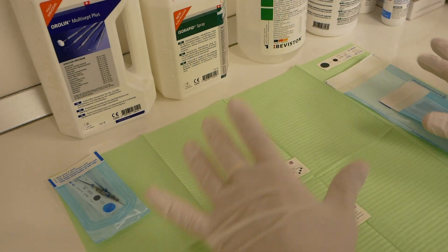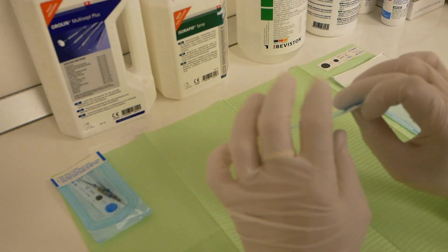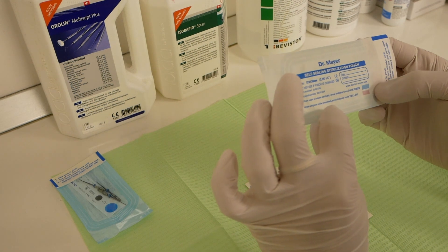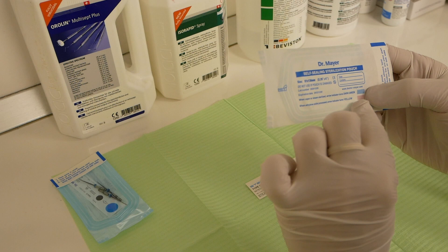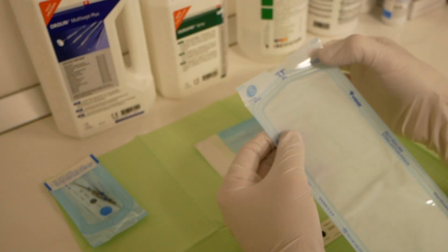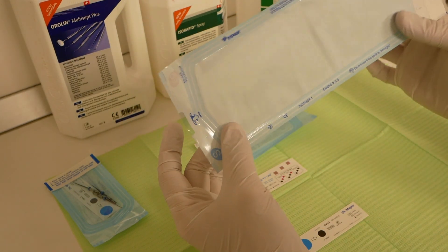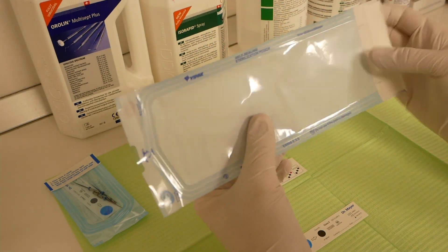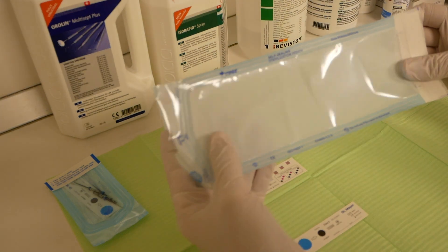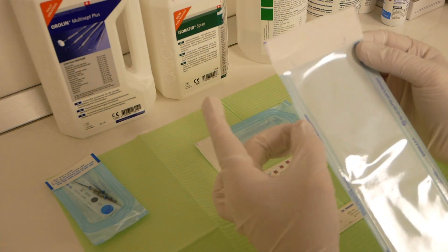Some higher quality pouches also integrate this Class 5 indicator into the pouch itself. As you can see, these ones only have a Class 1 indicator strip — both for steam sterilization and ethylene oxide sterilization. This will change color when exposed to temperature. Certain bags have them just below the plastic sheet, but the higher quality ones that integrate the Class 5 indicator have it somewhere inside the bag.